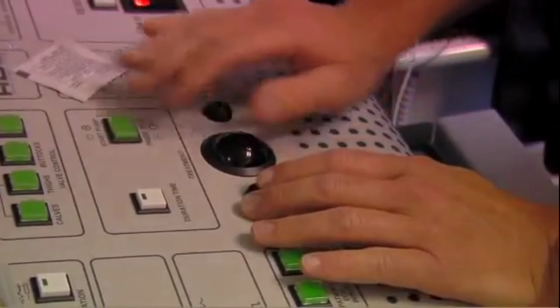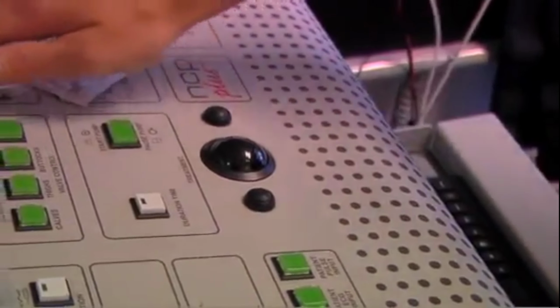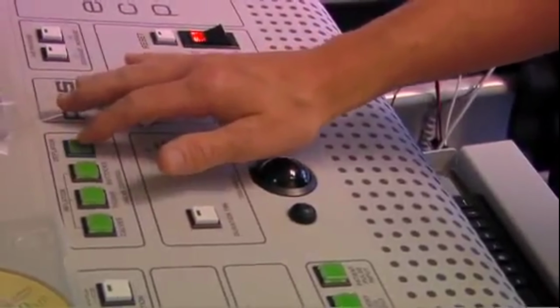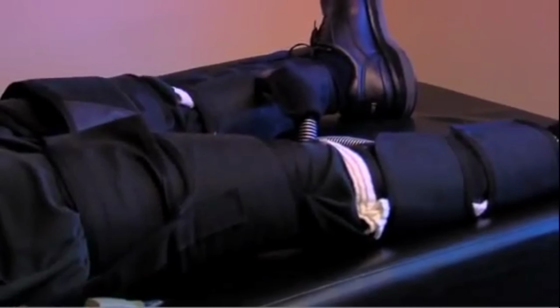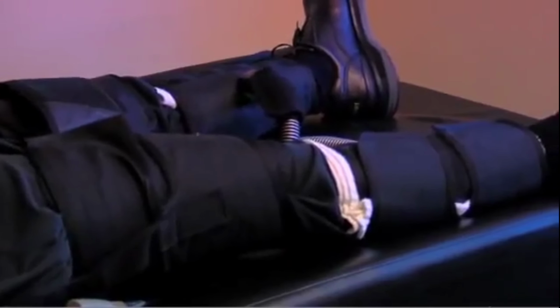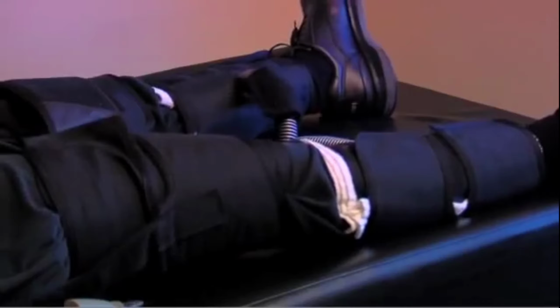So we're all wired up. I've got a pulse oximeter here to measure my oxygen content. I've got electrodes on my heart. And the PAT is sort of like that same thing. Both of them basically release adenosine, so this is expending energy and burning up your ATP. And adenosine is a vasodilator and opens up the circulation so the stem cells can get into the tissues better.